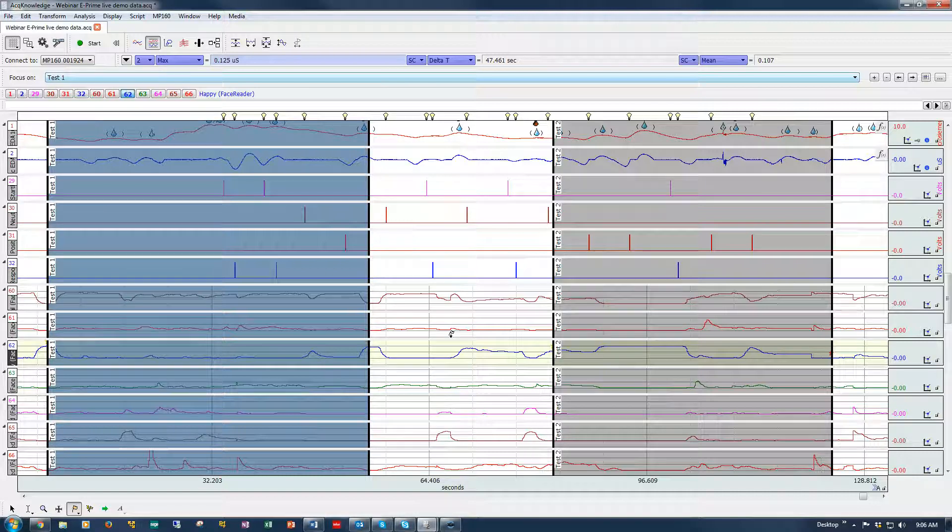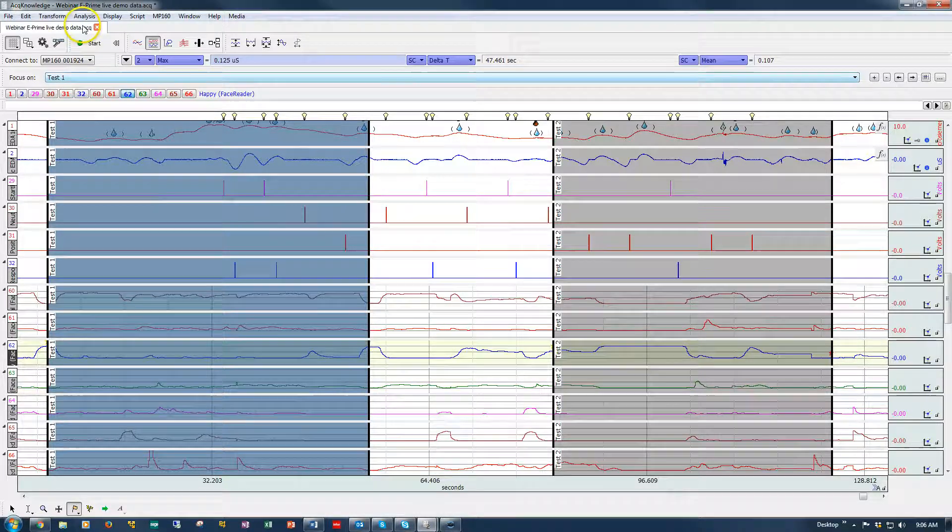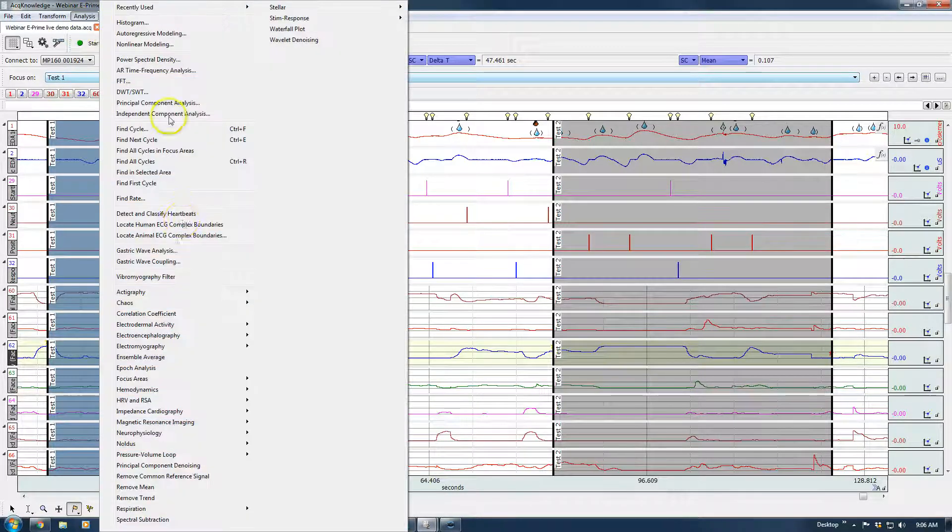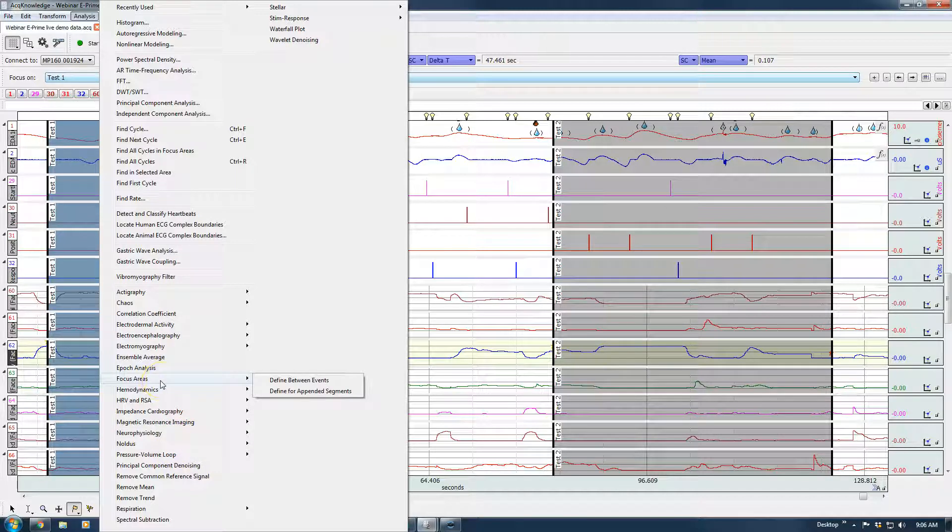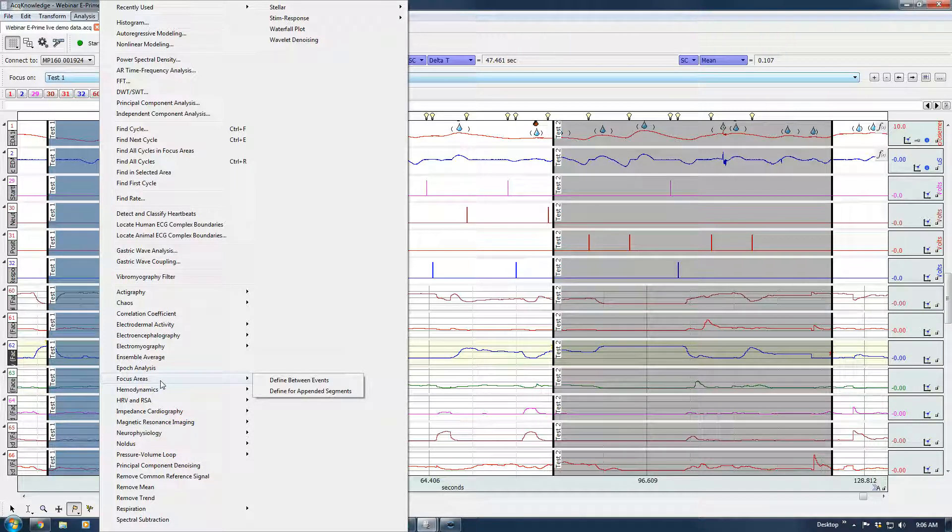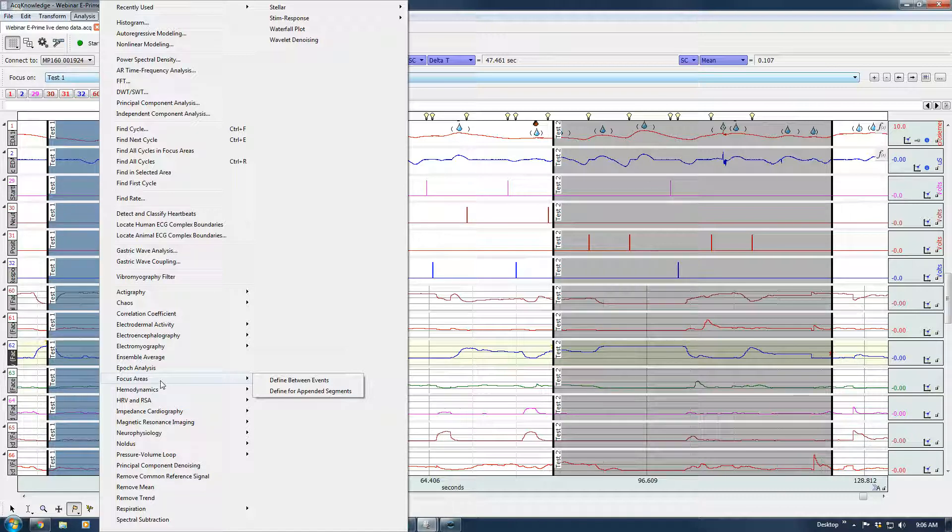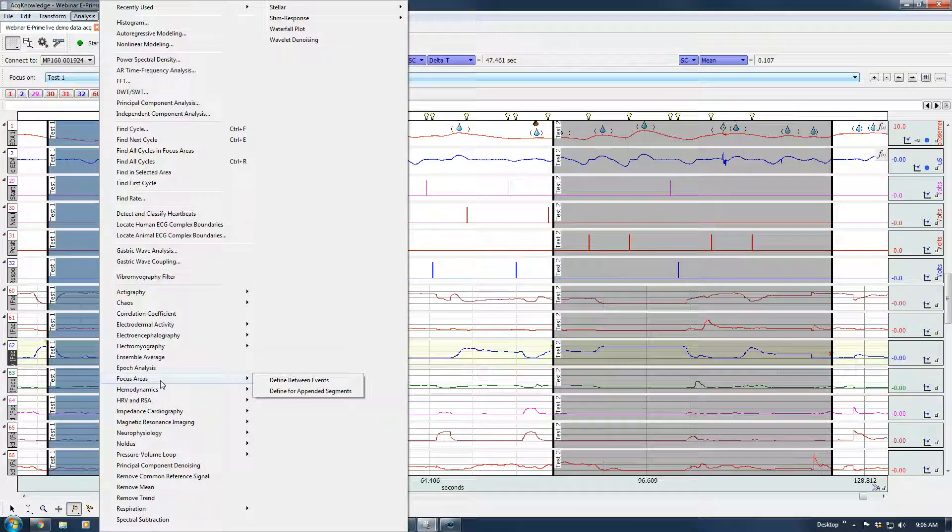So that gives you an overview of the focus area tool that allows you to automatically create these regions. So that when you do your analysis, you can just focus on the parts of the data that are really important. So that concludes this screencast.